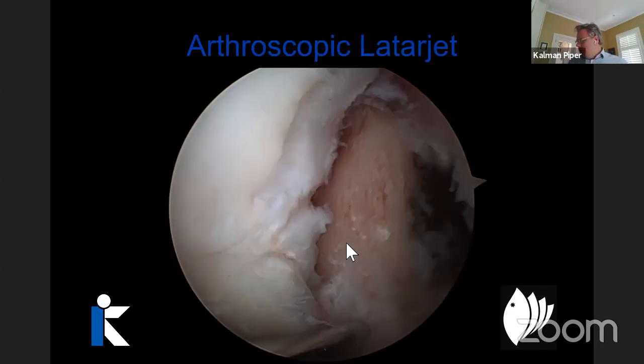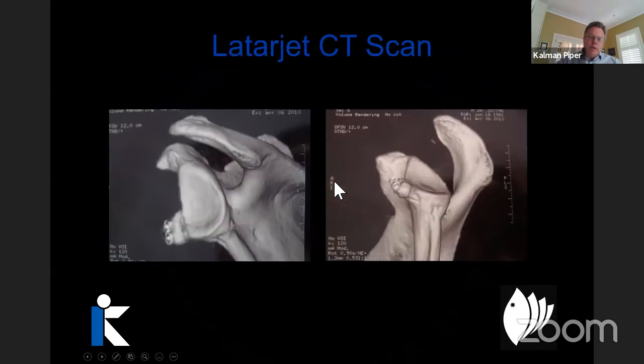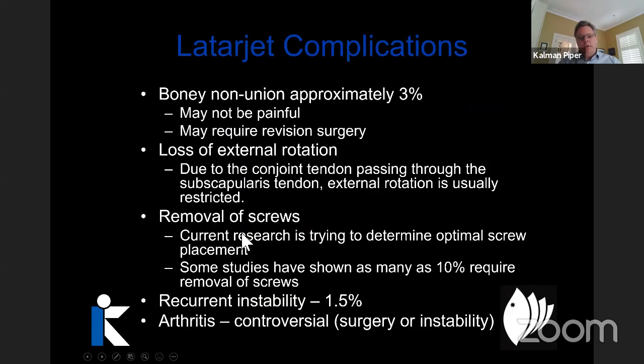I previously used to do arthroscopic Latarjet, so this is an older talk, but here you can see the positioning of the graft. One to 2 millimeters medial to the joint surface is fine, and then I would repair the capsule over the top. And this is what a post-op CT scan looks like with the graft and the 2 screw heads. But now I've gone back to doing open Latarjet procedures rather than arthroscopic.